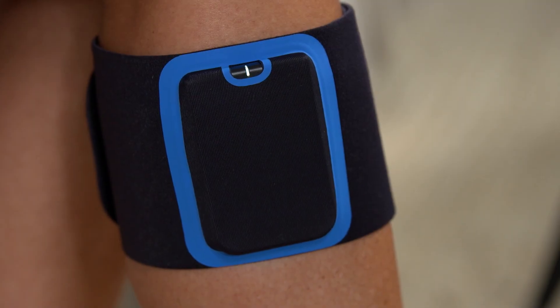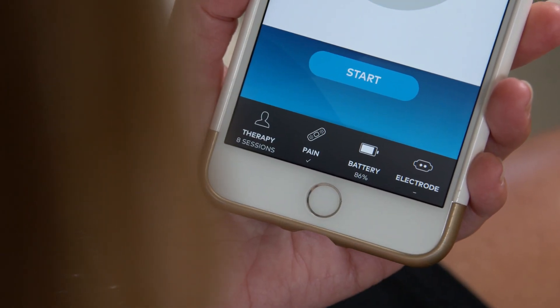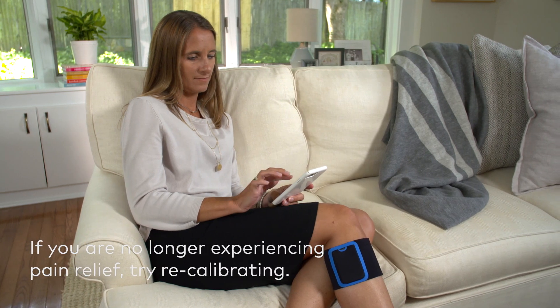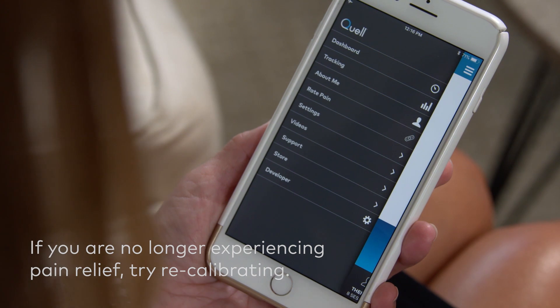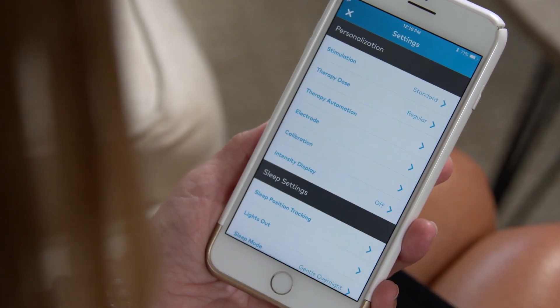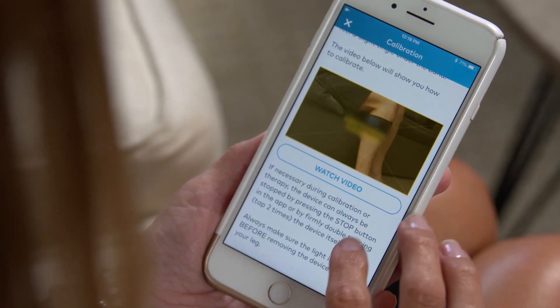To stop therapy before a session has ended, double tap the device with your fingers or stop therapy within the app. If at any time you feel that you are no longer experiencing pain relief, you may recalibrate your device simply by repeating these steps. Calibration can be found under settings within the Quell app.